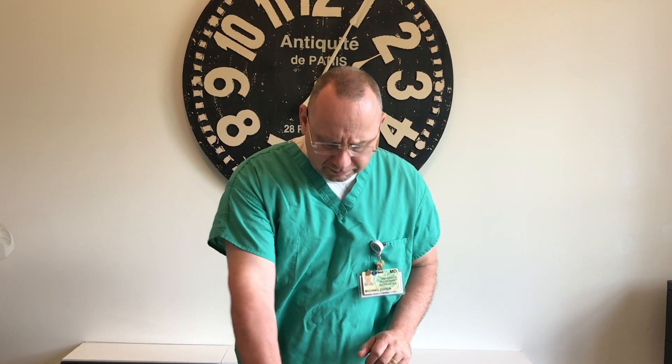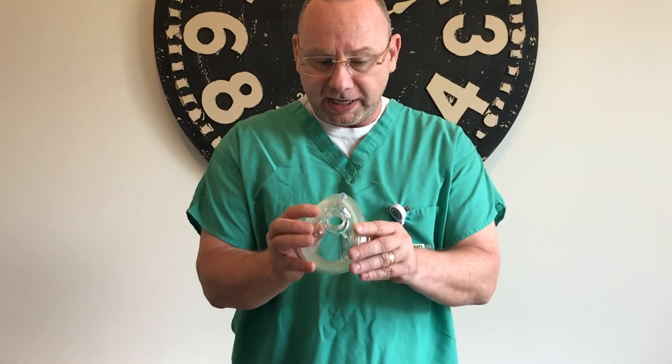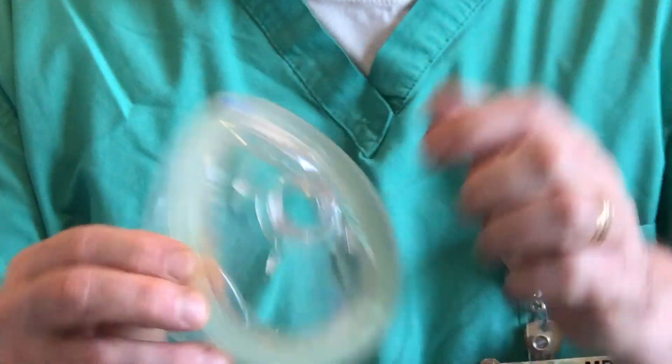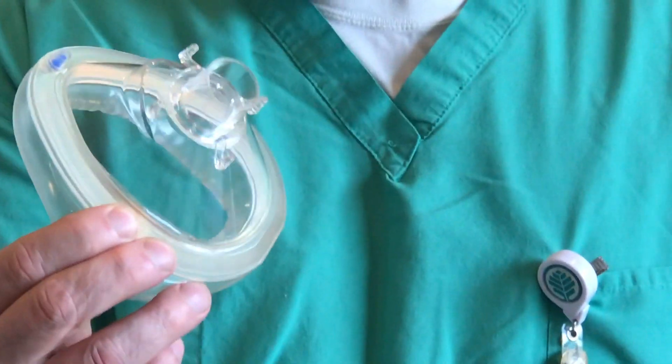So in the ICU — I know you guys have seen this a million times — an Ambu bag. This is an Ambu mask for your Ambu bag. Now on these there's four little spikes. Can you zoom in there? There's four little spikes. This is the thing that's actually going to be used to hold this to your face.